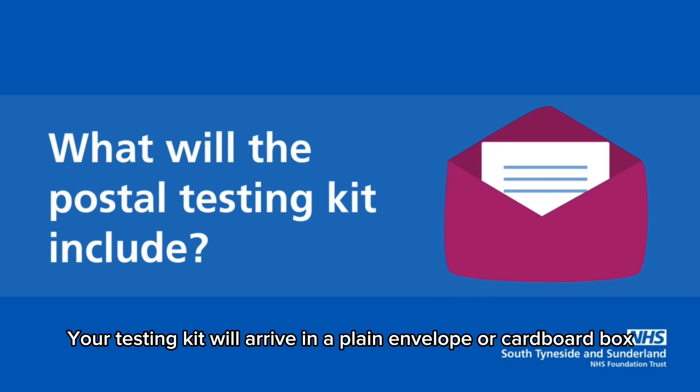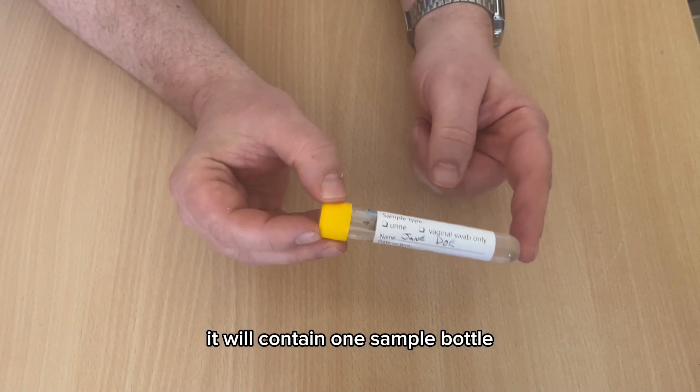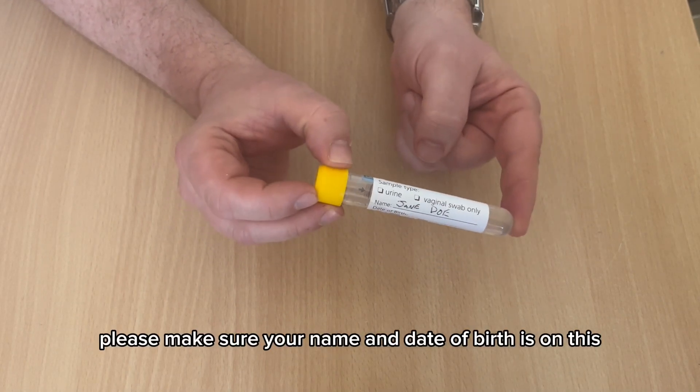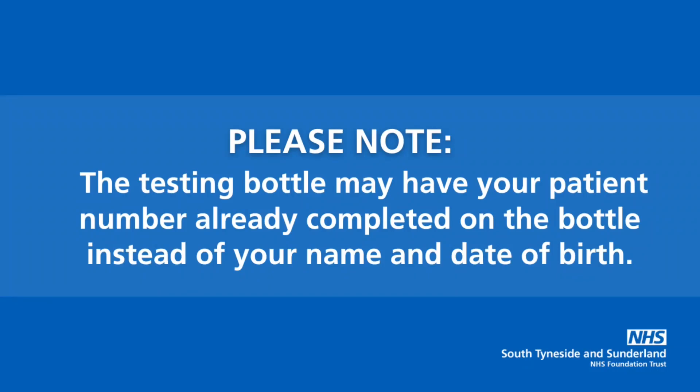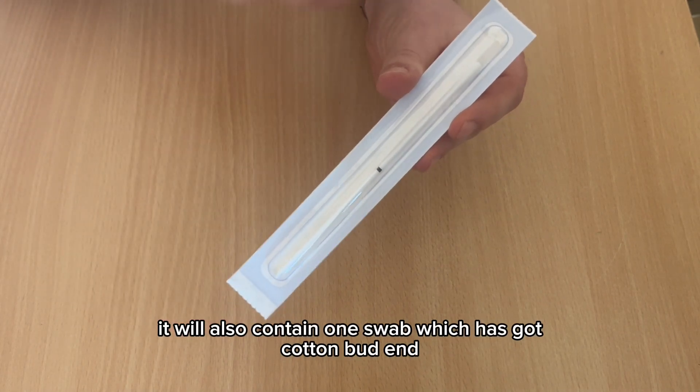The testing kit will arrive in a plain envelope or cardboard box and will contain the following: one sample bottle — please make sure your name and date of birth are on this — and one swab which has a cotton bud end.